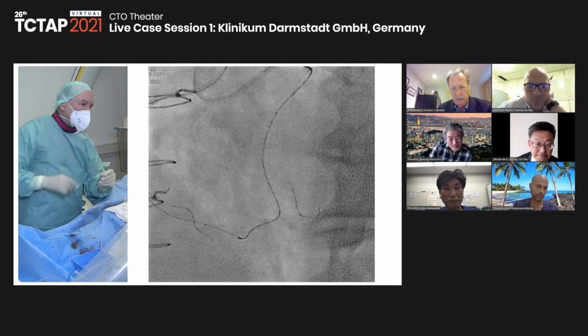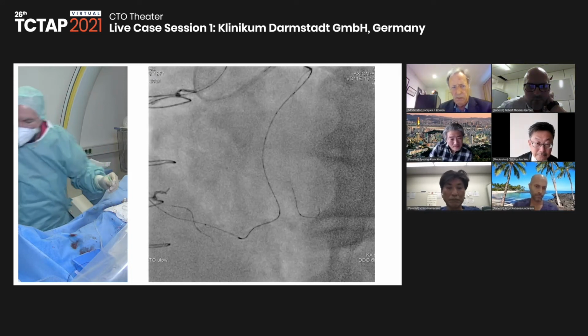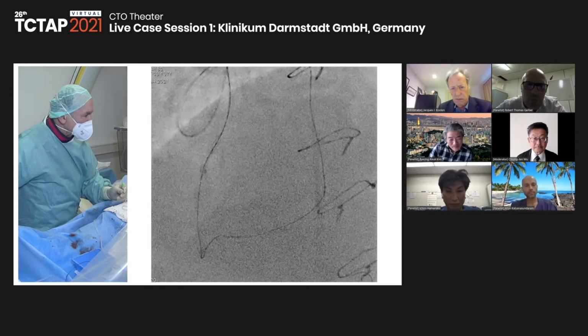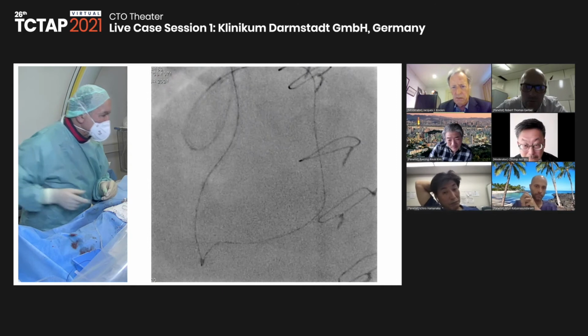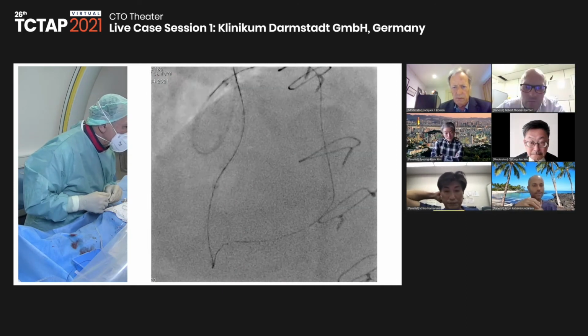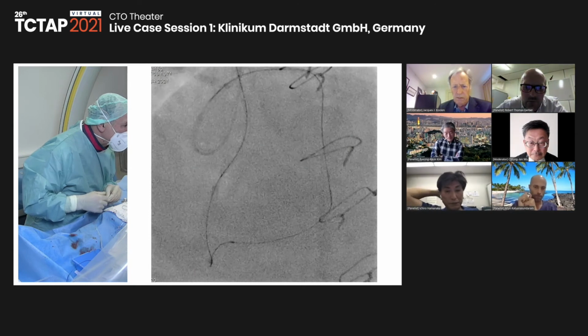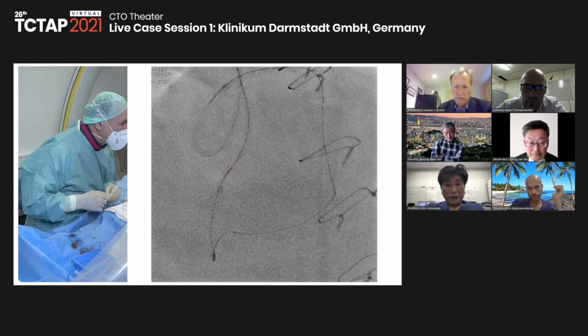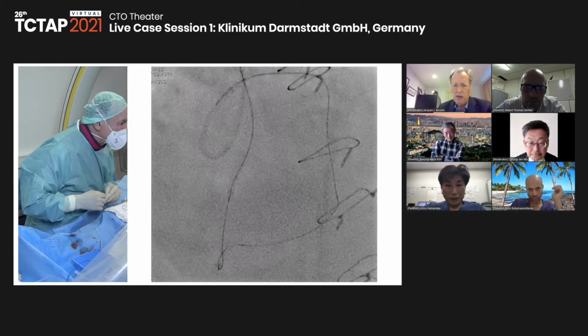Let's see. I have redirected my wire. You saw. Let's check the other plane, how it looks here. Looks good. Doesn't look too bad. Do you feel much resistance there? Yeah.